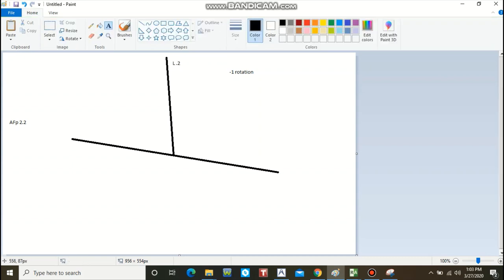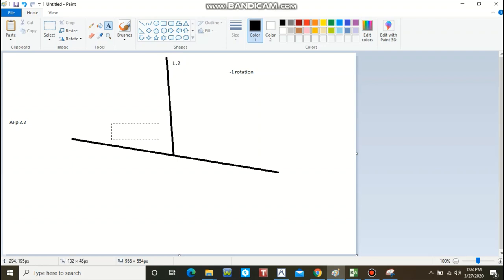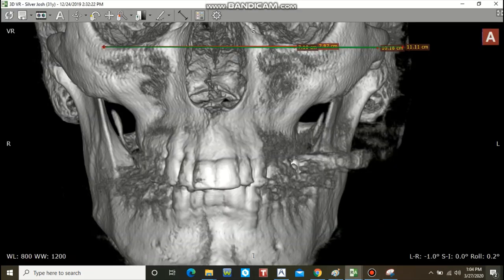So if I have a left 0.2 head tilt and I'm high by 2.2 degrees on that same side, that means my ACD is on the left by 2.4 degrees — left ACD 2.4. We're all done measuring the ACD. We know that to get this film neutral, we need 0.2 degrees of roll and negative one degree of rotation.